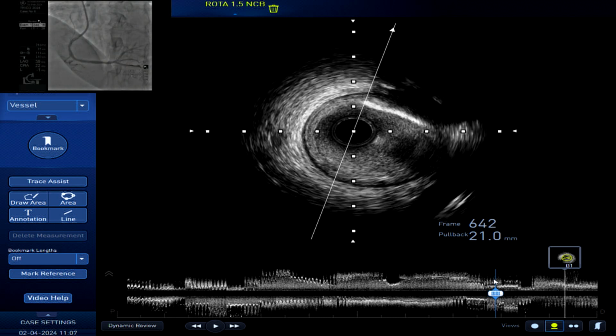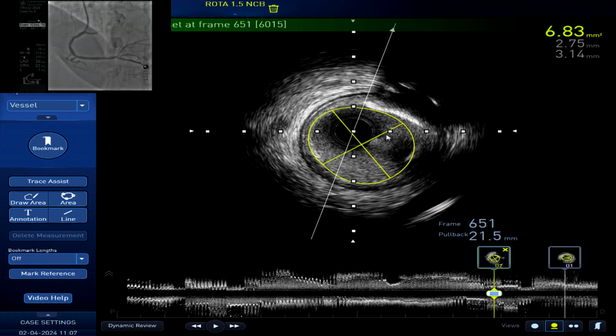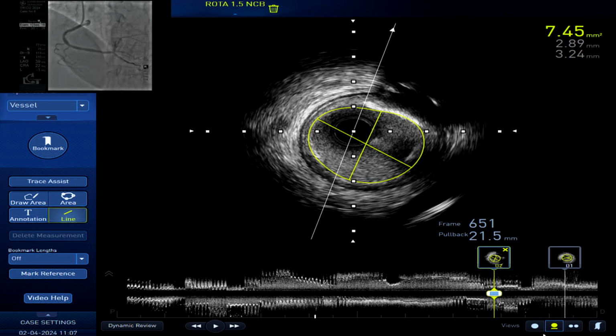So we'll take a 3 millimeter stent distally, and maybe give me 3 by 15, and these are calcified lesions, so my preference will be Xience platform, preferably, or Onyx, but here I'll take Xience. Xience Alpine 3 by 15. The length is 15, right? 15. Yeah.